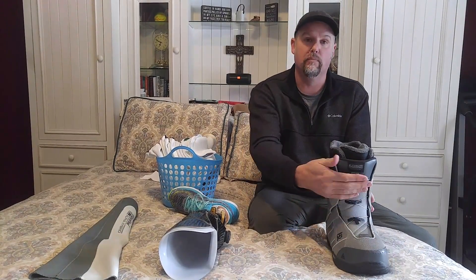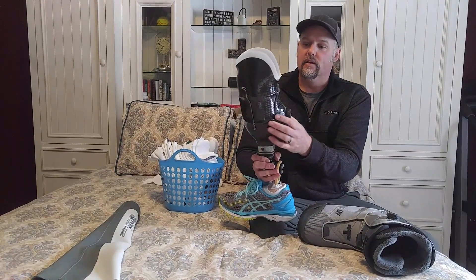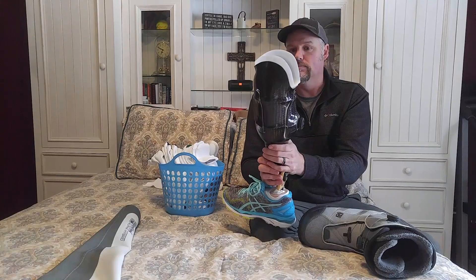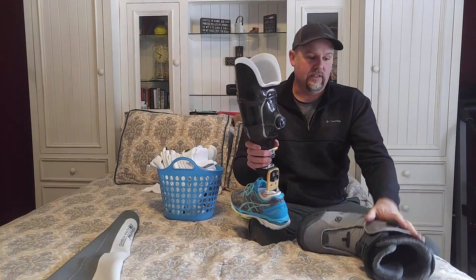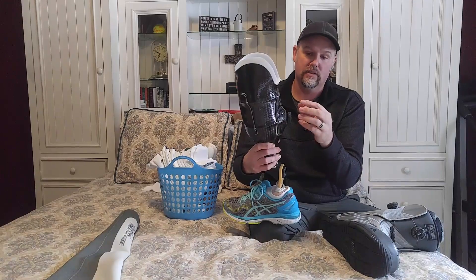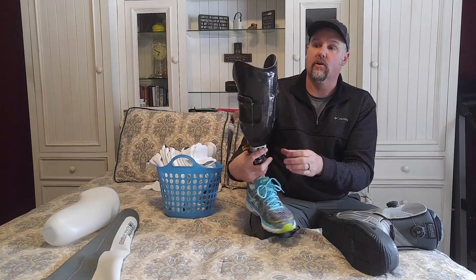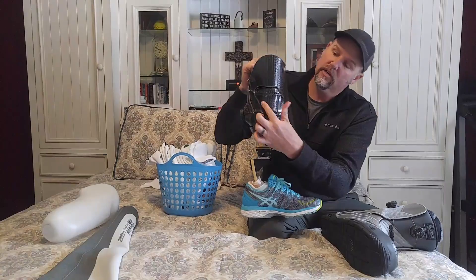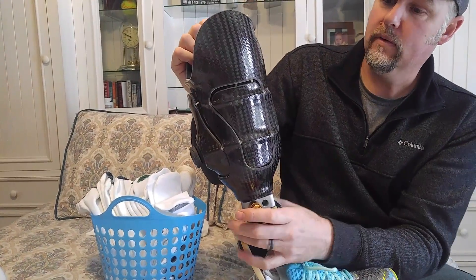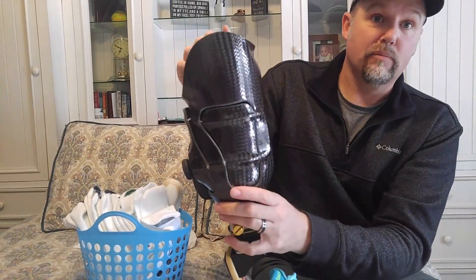What Click Medical did is they took the BOA systems and adapted them to medical uses — wrist braces, removable casts, above-knee and below-knee sockets, and upper extremity sockets. It's the same exact dial; you can see these dials are identical. They build this dial into your socket. This is really a very traditional socket — nothing different from any other carbon socket, except these panels have been cut out and these lace channels have been laid into the socket as it was laminated. Once they lay all the laces in and laminate over the top, they come back with a cast saw, cut these things out, and thread it like a pair of tennis shoes almost.